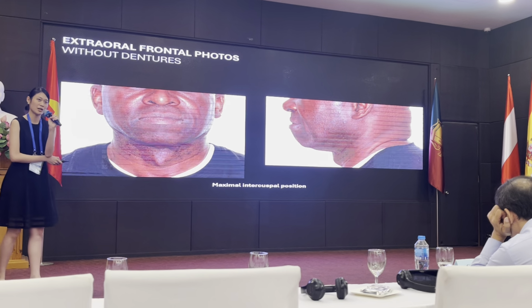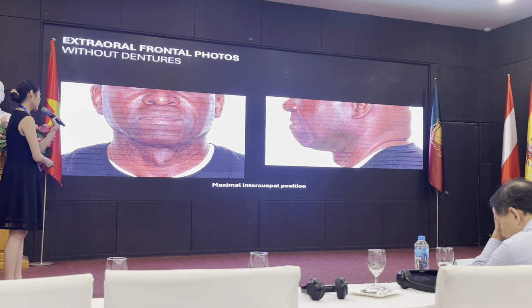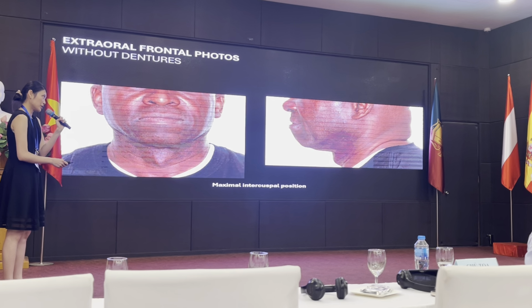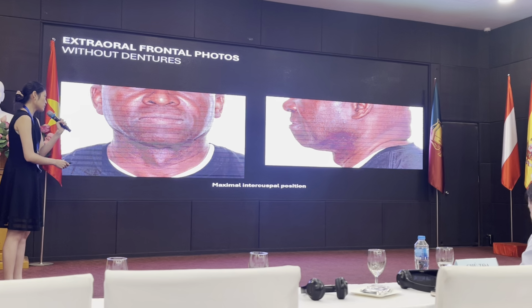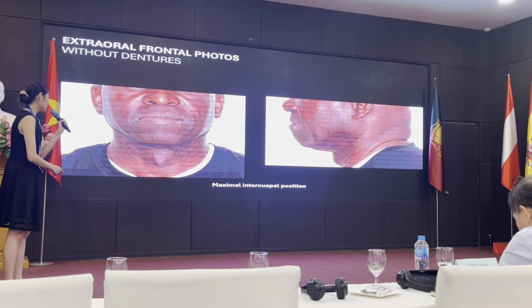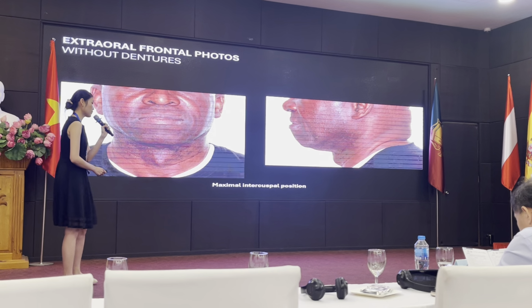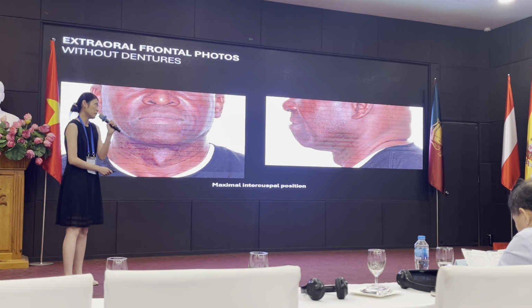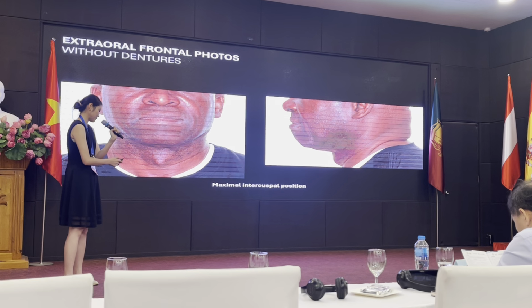So how do I start? I spend a lot of time doing the prosthetic implant planning in this case. So first I evaluate the patient's vertical dimension. And this is when the patient closes down at the maximum intercuspal position. And we don't just want to see the patient from the frontal view, but also we want to evaluate the patient from the lateral profile view. If you see a concave facial profile, that is very likely the patient has loss of vertical dimension.